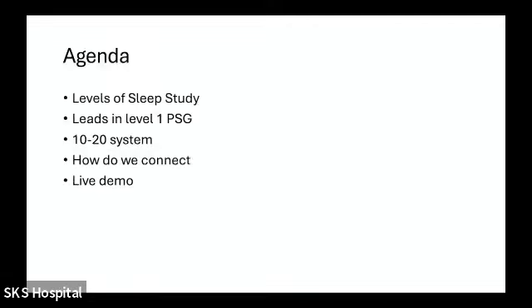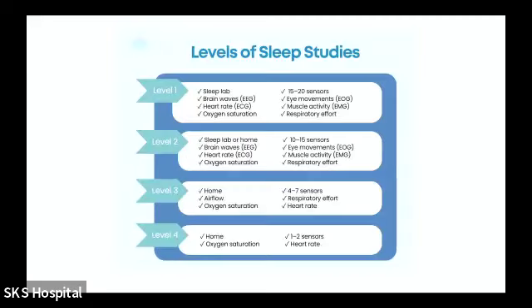So coming to the initial presentation, our agenda for today is levels of sleep study. What is level 1, 2, 3, and 4? Leads in each, in level 1 polysomnography. How to understand the 10-20 system and how do we connect? And then we'll go to the live demo of today's patient.